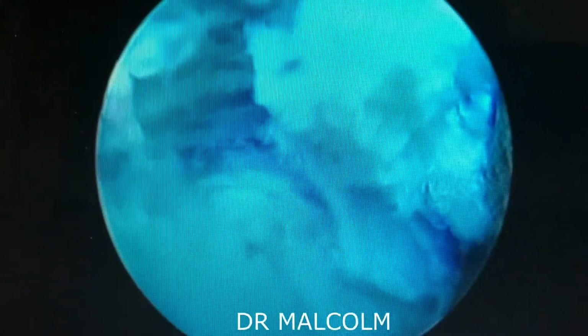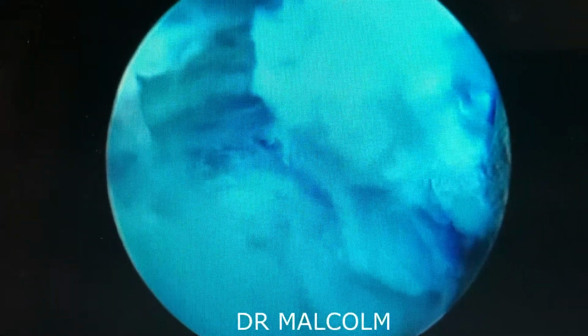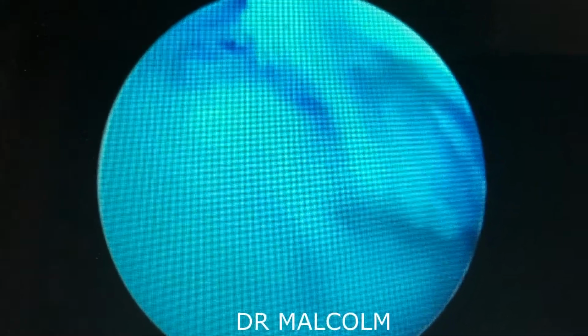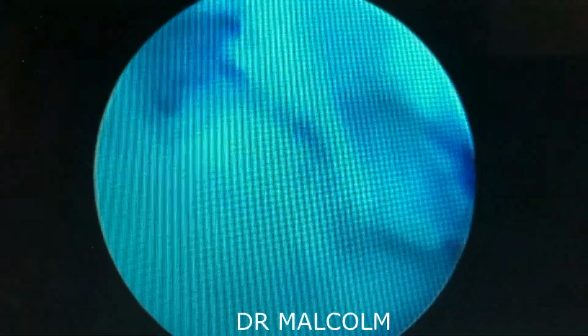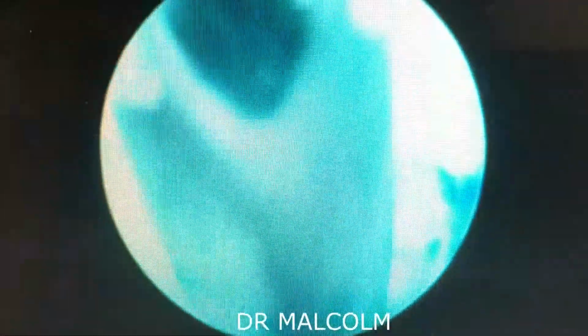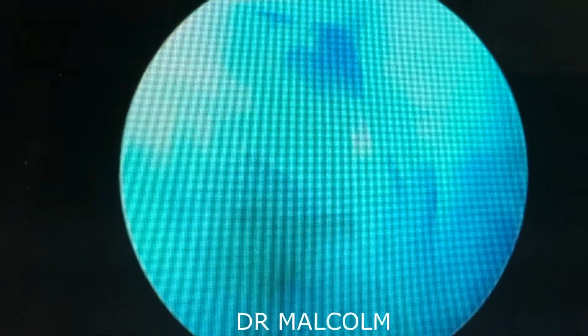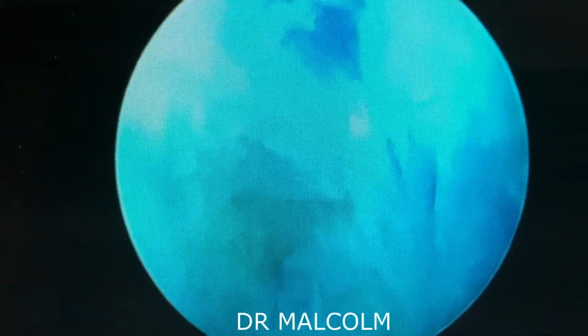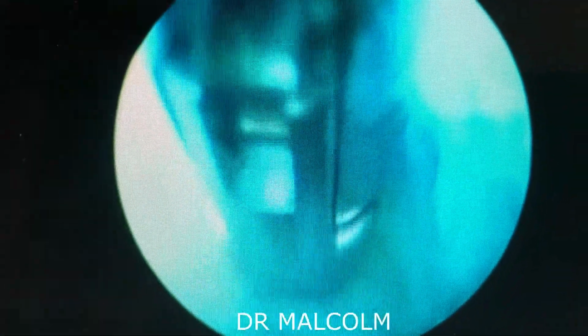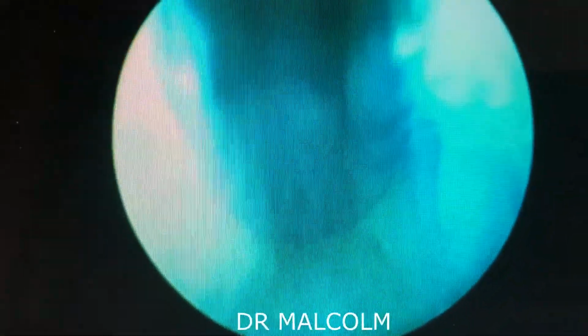Initially, one does not see much. One has to probe and go deeper in the fibers, more towards the surface, to find out the pockets of annular entrapment or nuclear entrapment within the annulus. These are times when you begin to doubt yourself and wonder where the annular or nuclear fragment trapped within the annulus is. But slowly probing, checking out every loose pocket, then starts yielding results.